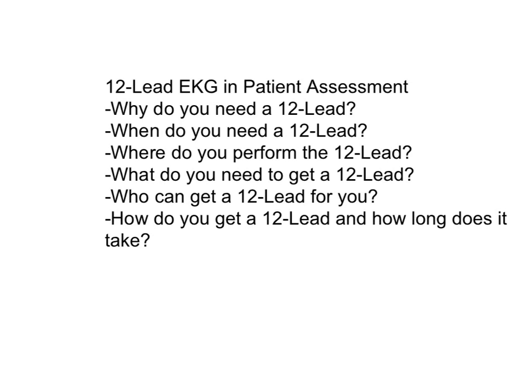So first off, why do you even need a 12-lead EKG? The answer is that the limb leads don't provide you with a clear enough view and enough views. You need the high definition view of the 12-lead where there are no filters, and if you see 1 millimeter of ST elevation, it really is there in 12-lead mode. In simple limb lead mode, it's not there. You can't rely on it being there.